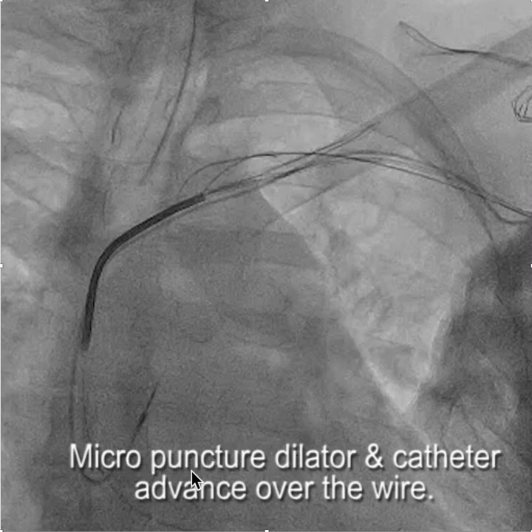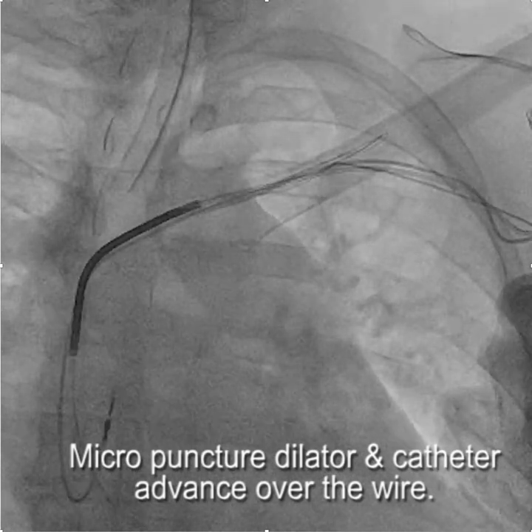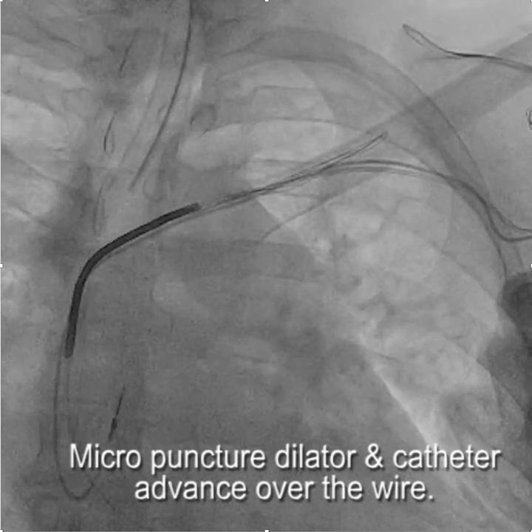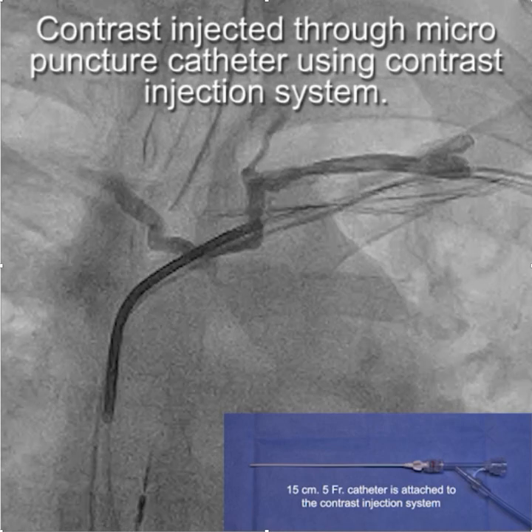What we're going to do is advance the micropuncture dilator with the catheter over the wire — you can see us doing that here. Once we get the micropuncture system in, we'll take the wire out and hook it up to a contrast injection system: the micropuncture catheter attached to the contrast injection system, and then we inject contrast.